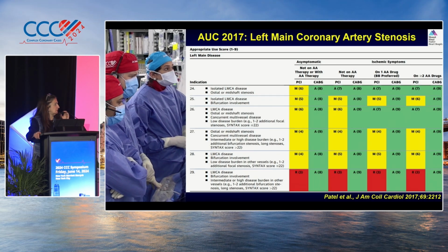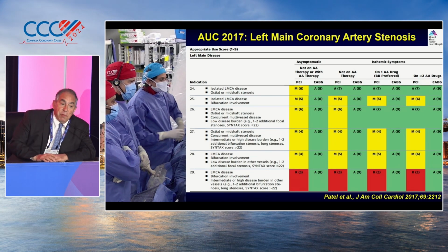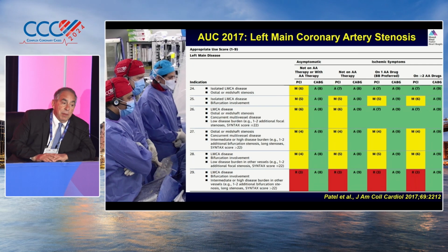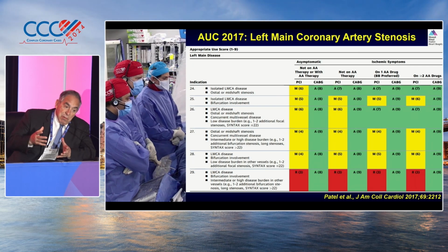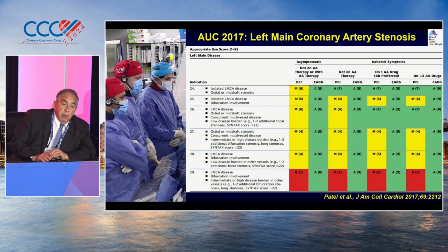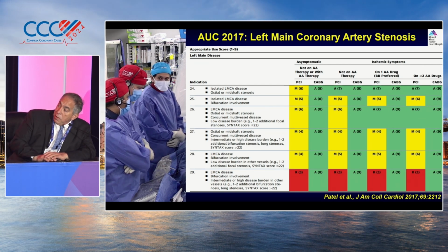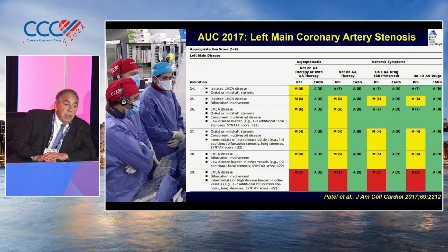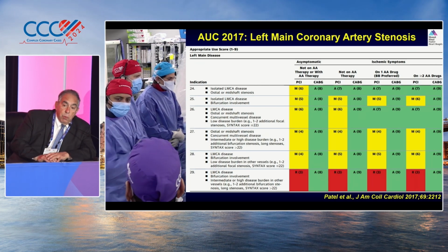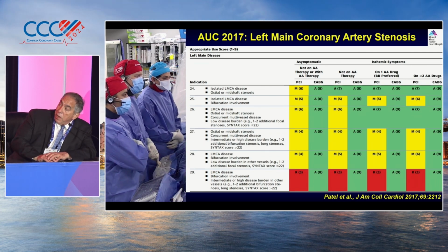Even though the EF is relatively preserved, we also have a very high PA pressure, so the potential for decompensation would be very rapid. I would recommend, we'll see what Dr. Keeney chooses to do, using a true flow balloon to give a mini valvuloplasty to give us a little margin for error. And then the bifurcation is not so complex that you're worried about wiring it and having prolonged ischemia. You could work from there as far as the PCI.